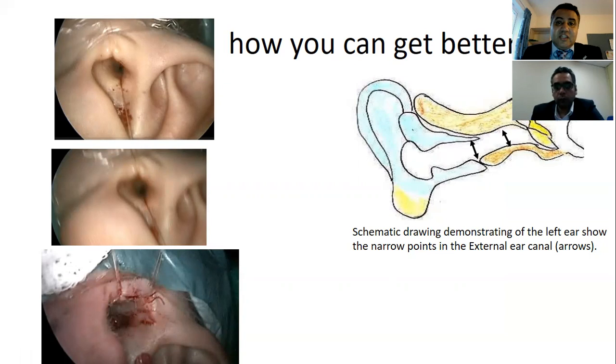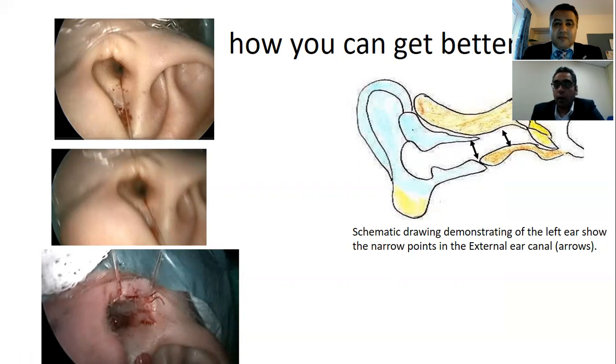It's very challenging to get a clear view while using the endoscopic approach, especially in restricted-access cases. What's your advice to overcome this situation, apart from retraction of the pinna? This is the important part of it.